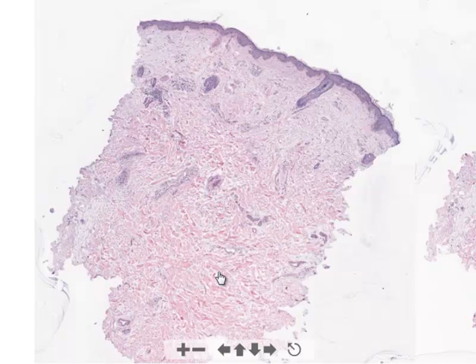Now, many dermatopathologists find it difficult, if not impossible, to differentiate between lupus and dermatomyositis on a microscopic slide. And oftentimes, when rendering a diagnosis, one will place in the comment that it is difficult to differentiate between these two entities histologically.